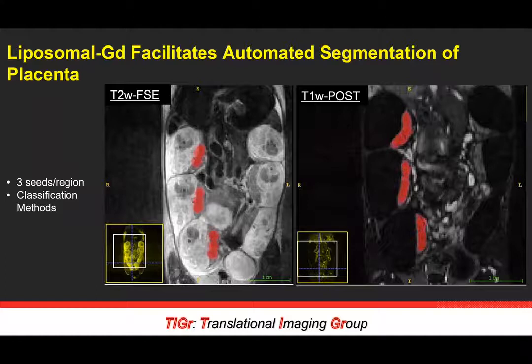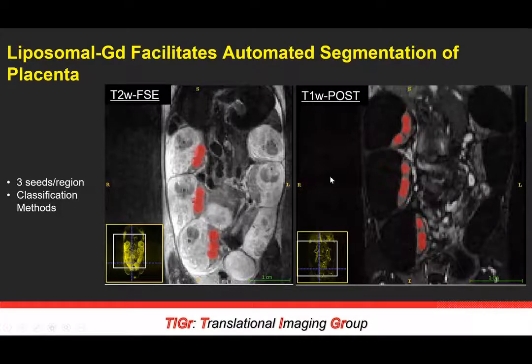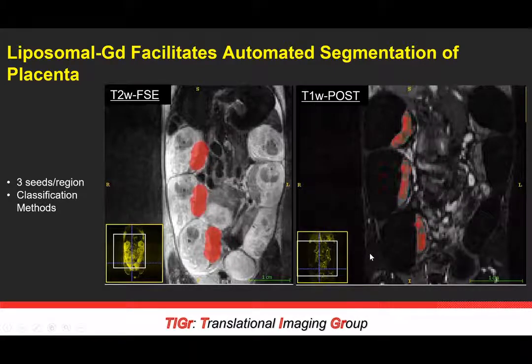A valuable feature of using our liposomal agent is that it facilitates automated segmentation of the placenta. Using ITK-SNAP — a freely available program — I've loaded DICOMs for both T2-weighted fast spin echo and post-contrast T1-weighted GRE sequences. With just three seeds added to three different placentas, the grow region in T2-weighted imaging has issues bleeding into the FPUs, whereas in the contrast-enhanced imaging it automatically covers just the placenta itself with minor issues such as occasional bleeding into the endometrial wall.